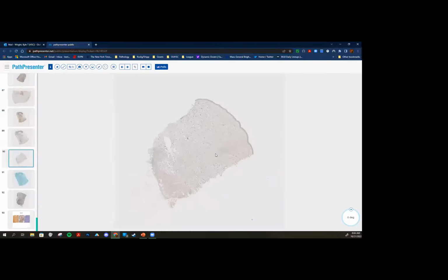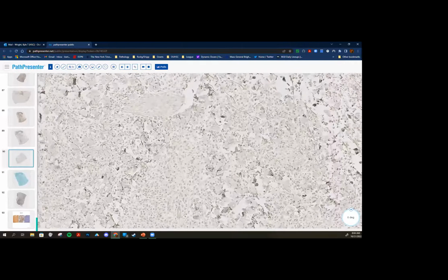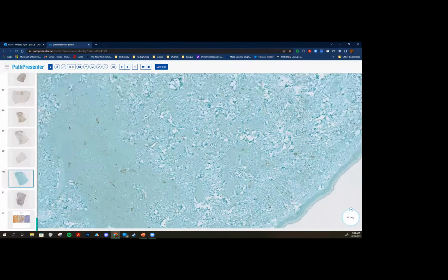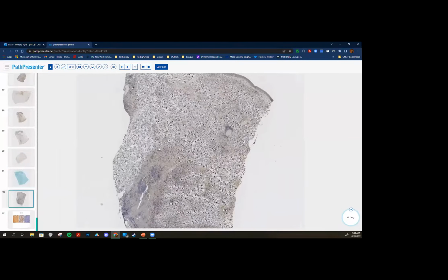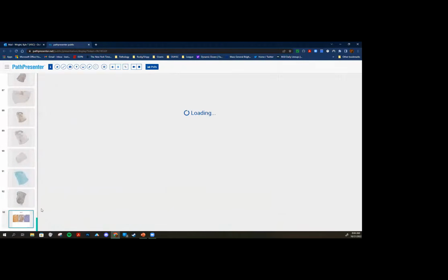This is TDT. Want to make sure we're ruling out those lymphoblastic lymphomas or leukemias, dead negative. CD123 for BPDCN, also negative. Ki-67, kind of low to intermediate. And I actually gave you 3 additional stains here on a slide.